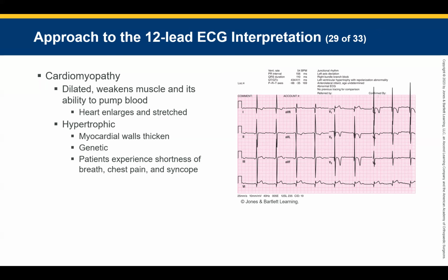Once again, do you even see any ST segment elevation here? Let's look at V1. For some reason, they have V1 at the bottom instead of your normal 2 or 3. That's a little annoying, but that's just what they have selected. So there we see V1. We have P waves. They're not great, but they're before those QRSs. We have QRSs and T waves. We have equal R to R's. We're slow, right? How slow are we? That says 54 up top. So we're in a sinus brady, we agree? That says junctional rhythm. Do you see that?